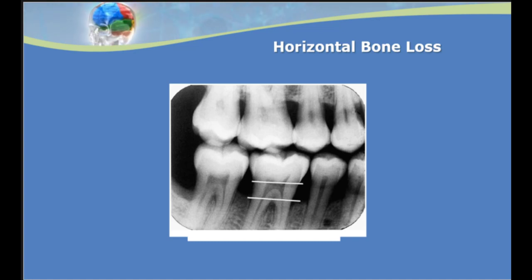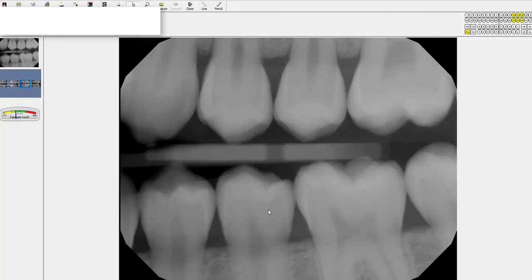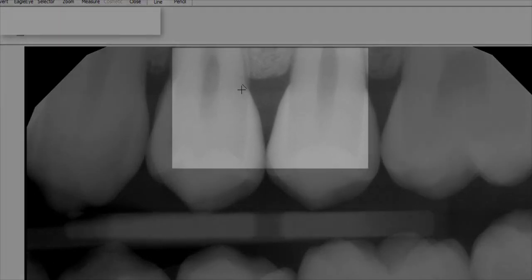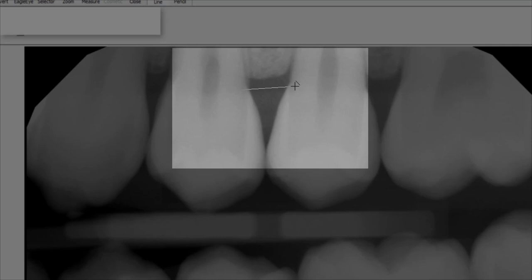There's a useful feature in Eaglesoft to help with this assessment. When assessing radiographs in Eaglesoft, there are tools to aid in evaluation — eventually you won't need them, but they're handy, especially when you're uncertain about bone loss. There's a line feature you can click; if it's not in your toolbar you can find it under Tools at the top. Instead of an imaginary line from CEJ to CEJ, you can actually draw that line from the CEJ of one tooth to the CEJ of the adjacent tooth.